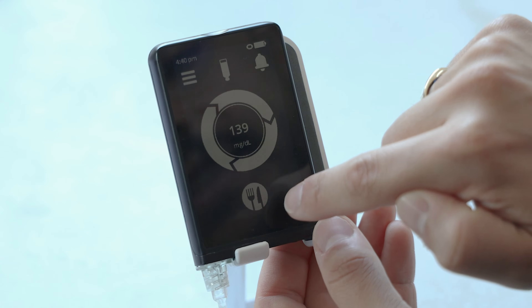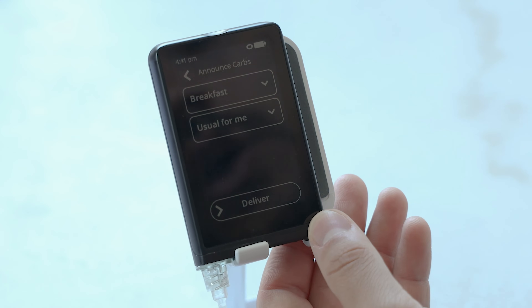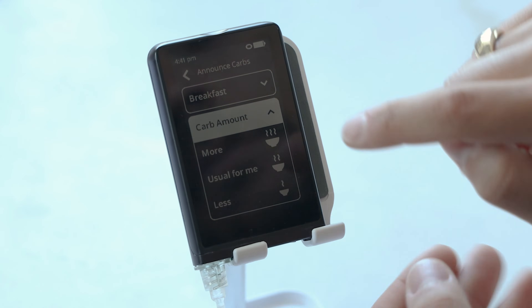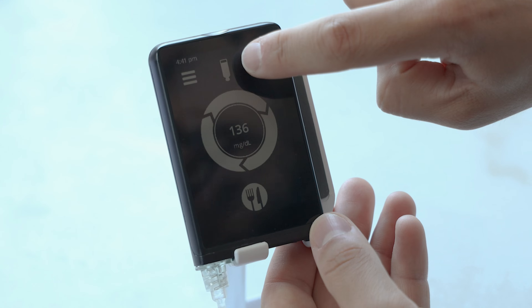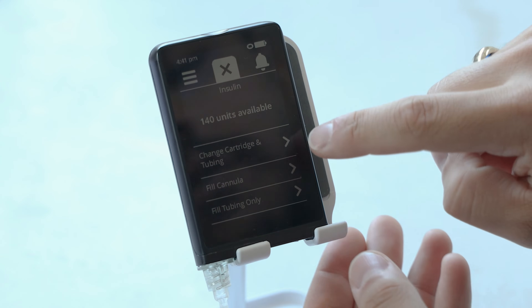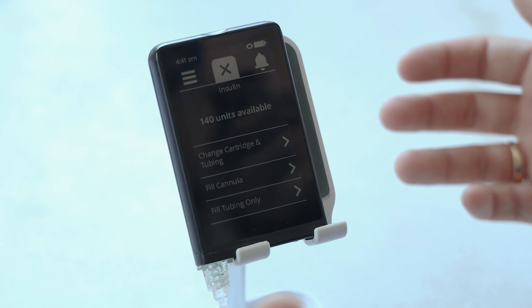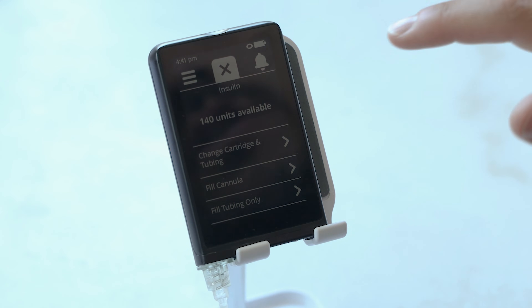To log a meal, there's a little fork and knife icon. With this pump, all you need to do is choose which meal it is — breakfast, lunch, or dinner. When you go in there, it asks you how large the meal is: more, usual for me, or less. From the home screen, there's also a little insulin vial on the top. From there, you can change your cartridge and tubing, fill the cannula, or fill the tubing only, and it even shows you how many units are available.